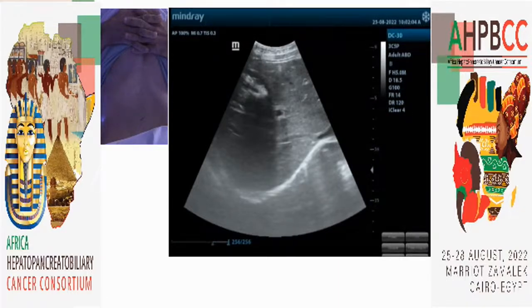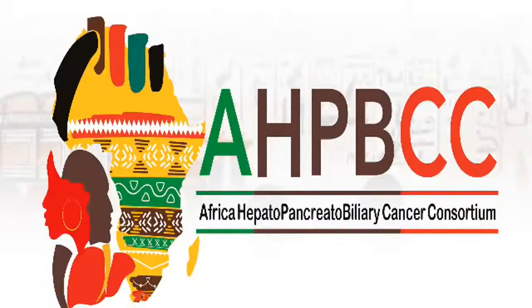What is the average time I need to do a scanning ultrasound for a patient with liver cirrhosis, if I'm going to look for any suspicious focal lesions? Such a case was not an easy one; it was an isoechoic lesion. So what's the proper time needed for a proper ultrasound examination of every patient? This is an important question. What is the duration of screening the liver with ultrasound? Dr. Yao, can you answer this?